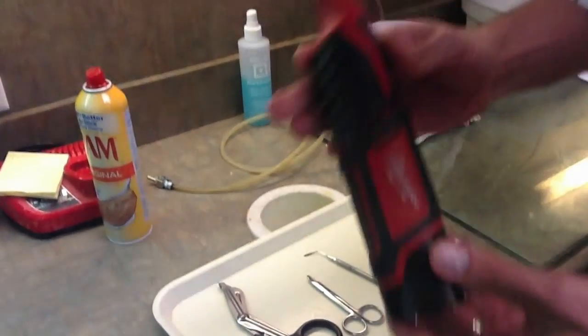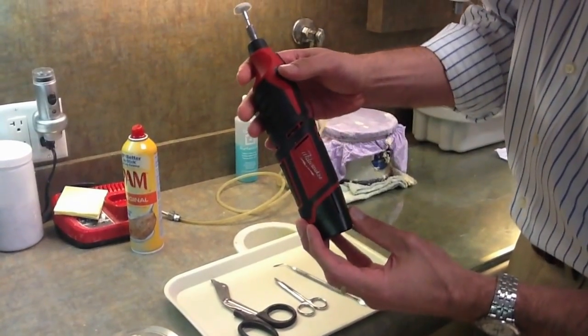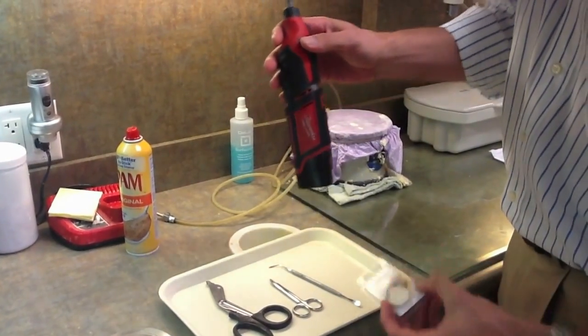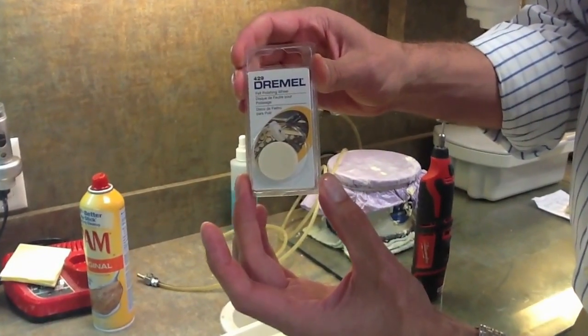Then finally we come through with the polishing. This is just a hand Dremel tool purchased at Home Depot, and what we found to work best is this felt wheel that you can purchase on Amazon.